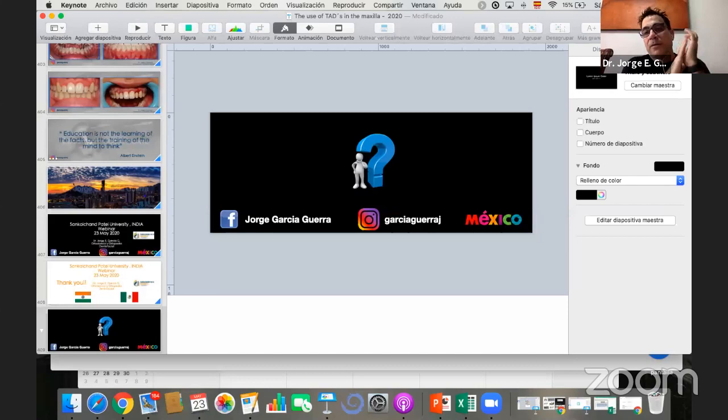Okay. There's a question from Dr. Raghu. How much was the total duration of canine traction into the arch in the last patient presented? In the last one, to get it to the arch, it was about 8 months. The total treatment time was a little over 2 years. Okay. Yes, they're not fast treatments.